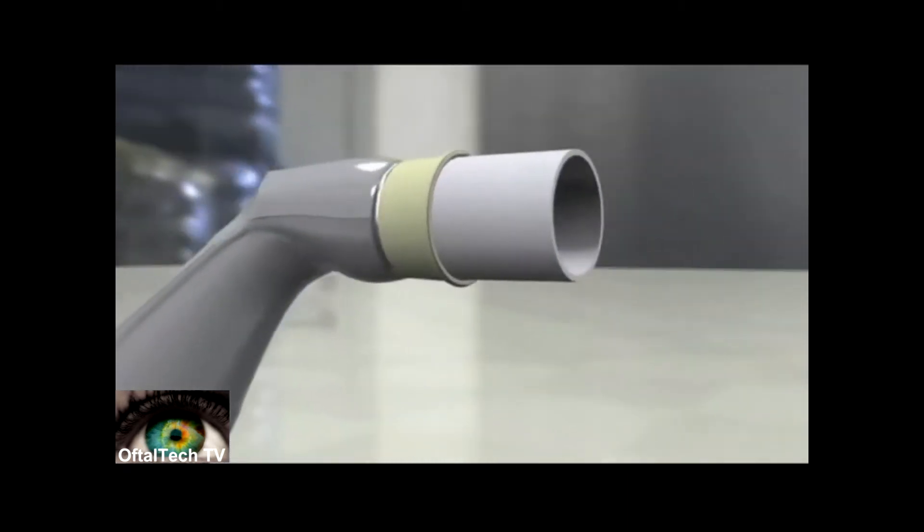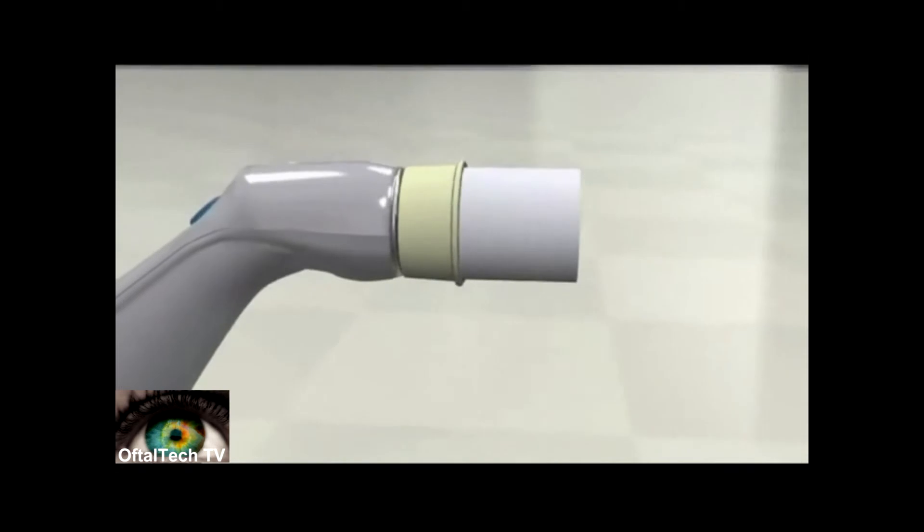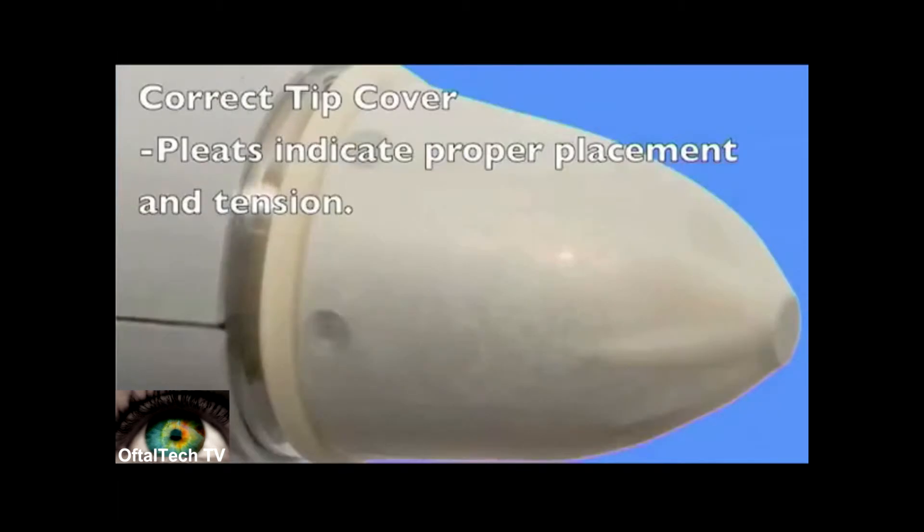Simply roll the cover on using the cardboard applicator. This photo is an example of a properly placed tip cover.